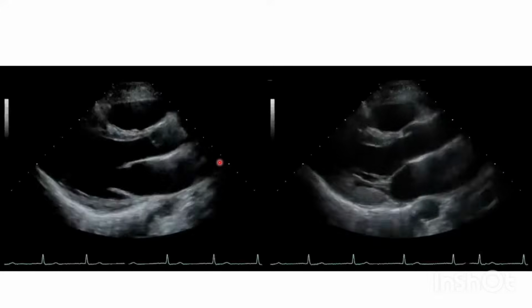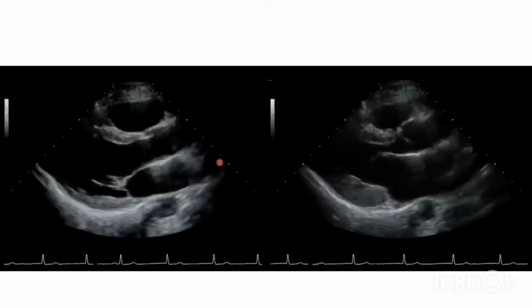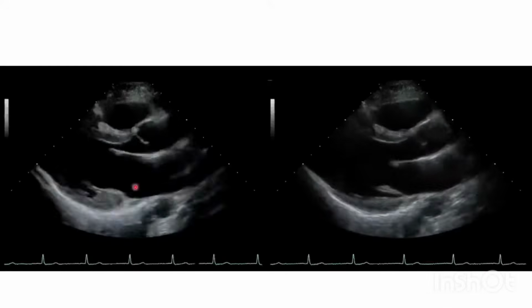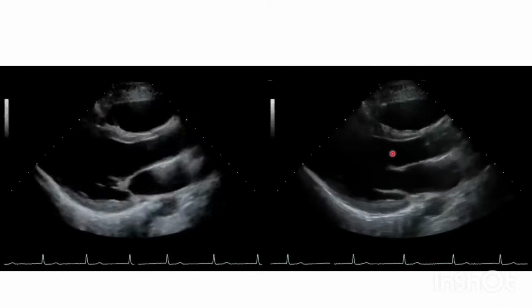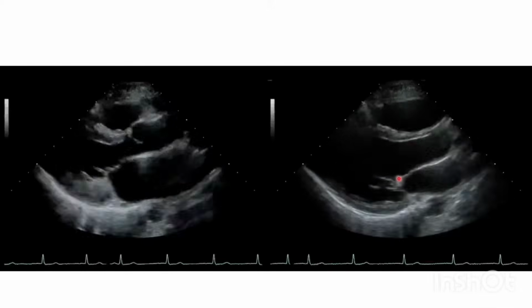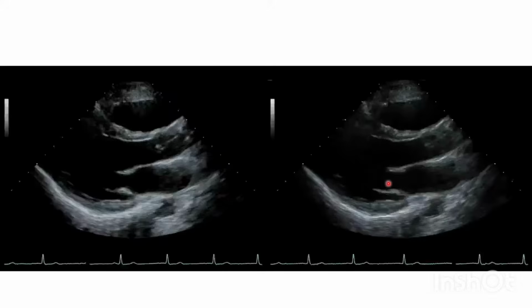This is the video image showing the difference between the various maps. So you can see that there is a difference in the shade of these grays. So it's our preference to choose which grayscale map we can use. The importance, why do we need more grayscale maps like this, is that maybe if we change the maps, we can detect various structures which are not visualized.